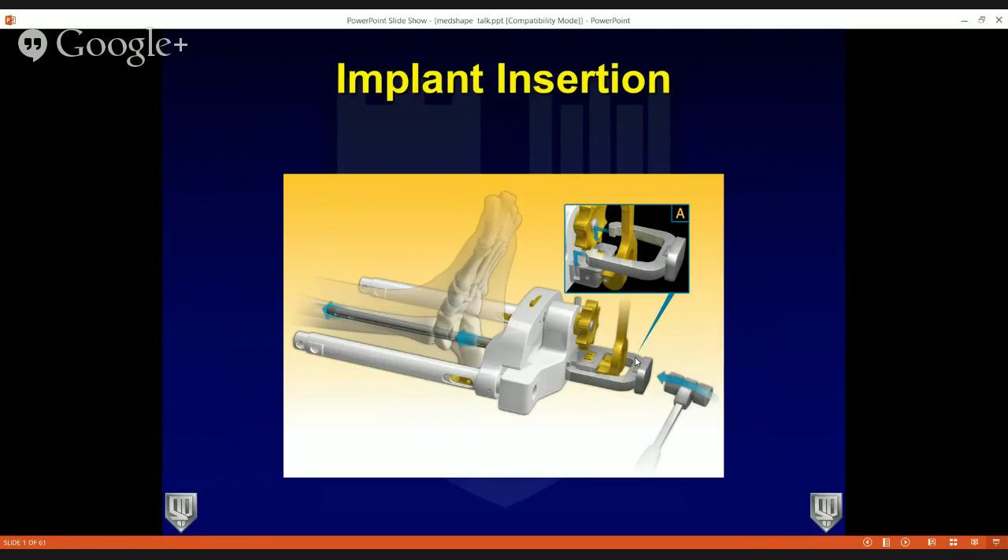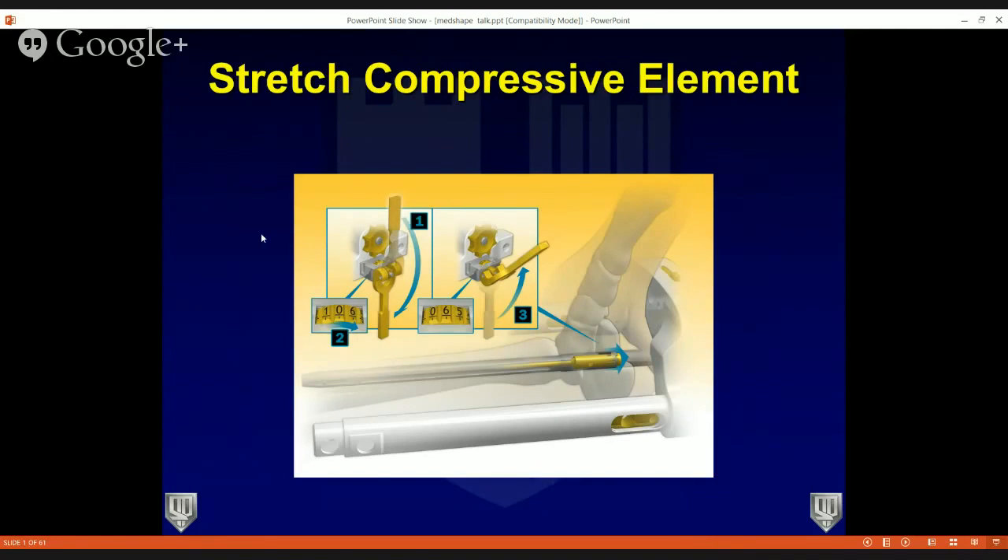There's a modular slap area you can use with a slap hammer to make sure you like the insertion and can insert the nail as far proximally as desired. Check on both AP and lateral views to confirm placement at the distal aspect and where the screws will be in the calcaneus and tibia. Now you get the stretch: take the lever arm, flip it down toward the floor of the room, dial how much compression you want — typically six millimeters — then flip the lever arm back up toward the ceiling.